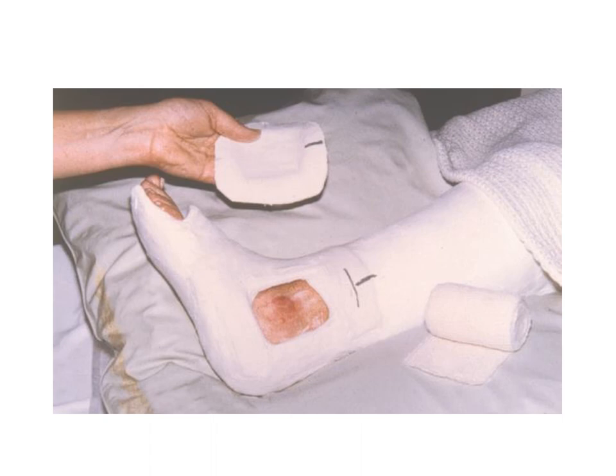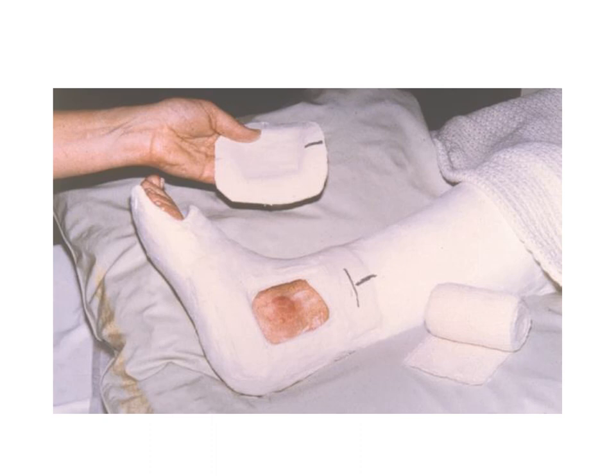Here is an example of a lid that has been made so that it can be taken on and off to inspect the underlying wound in the cast.